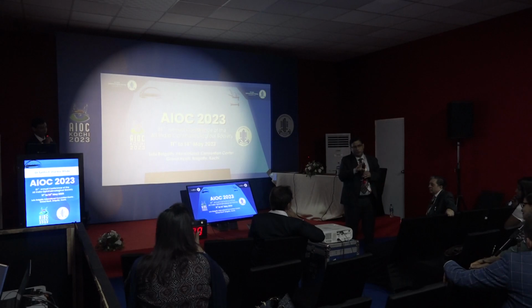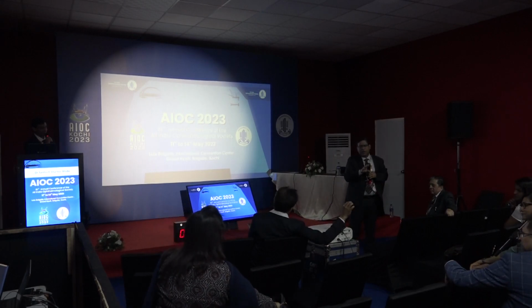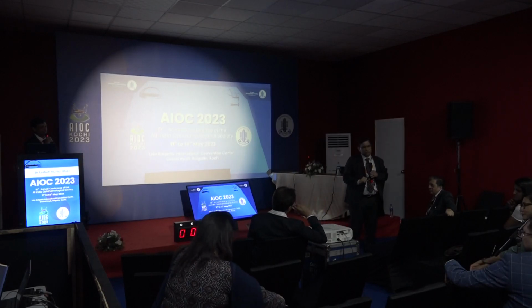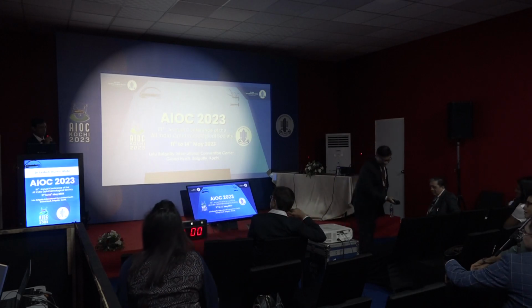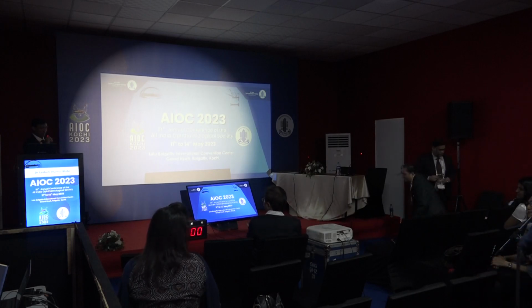You really don't want to do that. I think we should try time-tested methods. Absolutely. I was not successful, and I didn't even attempt it. So I think the take-home message is to use good viscoelastic devices while doing hypermature cataracts. Any queries from the audience?